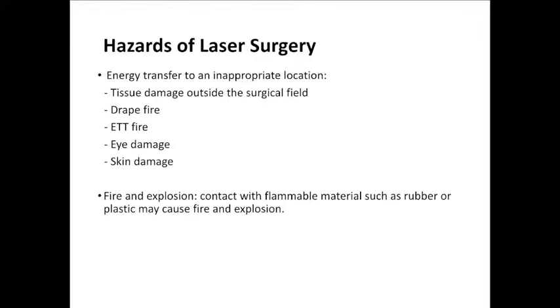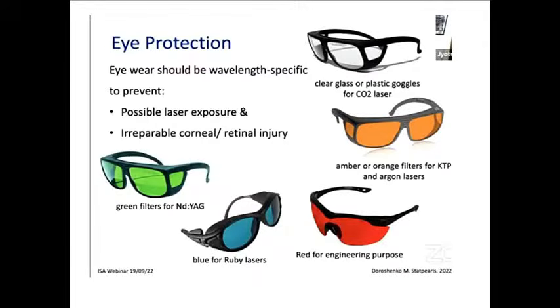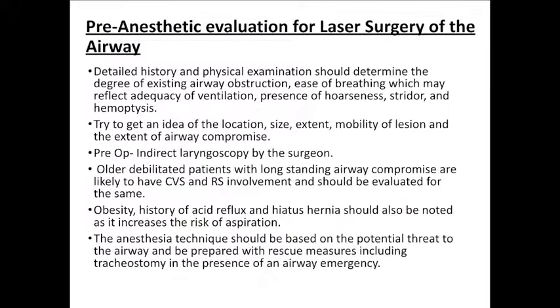Lasers are mostly used in ENT procedures, such as those of the vocal cords, nodules, and polyps, as well as in urology and neurosurgical procedures. The hazards are tissue damage, drape fire, endotracheal tube fire, airway fire, and explosion. So whenever lasers are used, eye protection is important, and these are the various goggles and eye gear which can be used for various types of lasers.